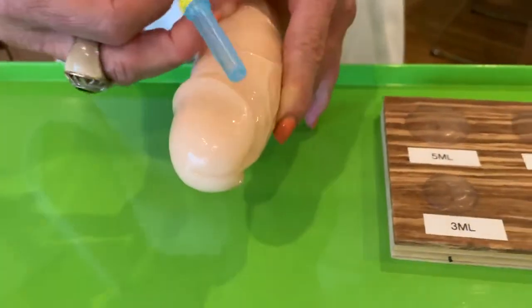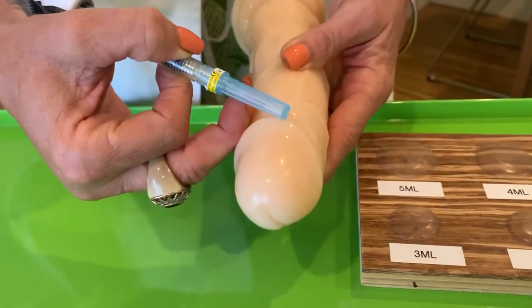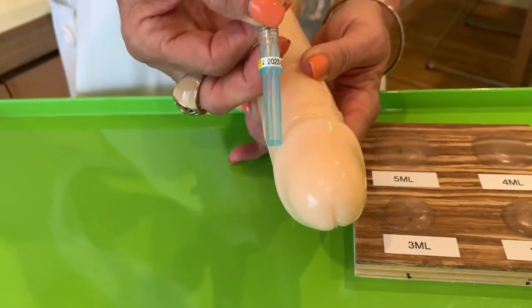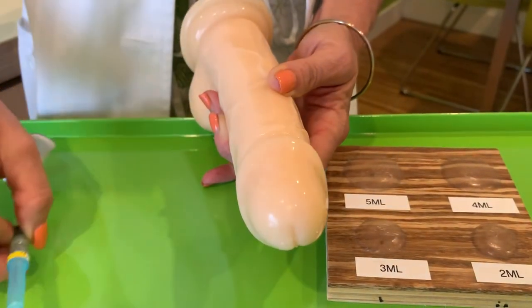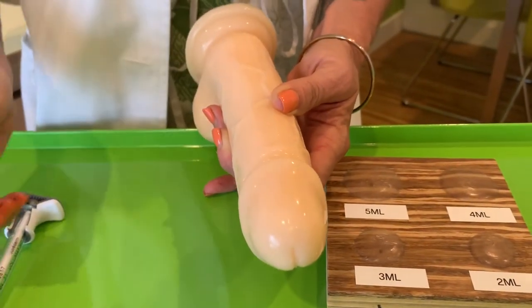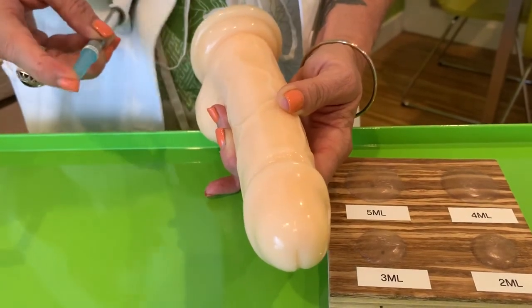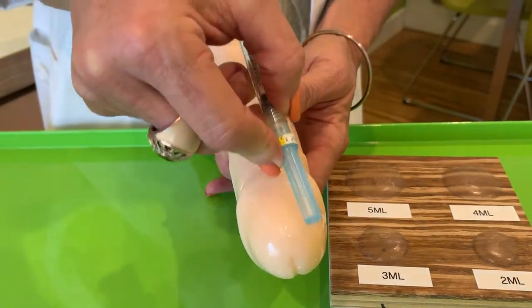I will start by etching out all of this rim, or the corona, all the way around. It really gives a nice enlarged corona. It stands out nicely, and then we go in and do the actual glans, where we go ahead and enlarge and fill out this way.